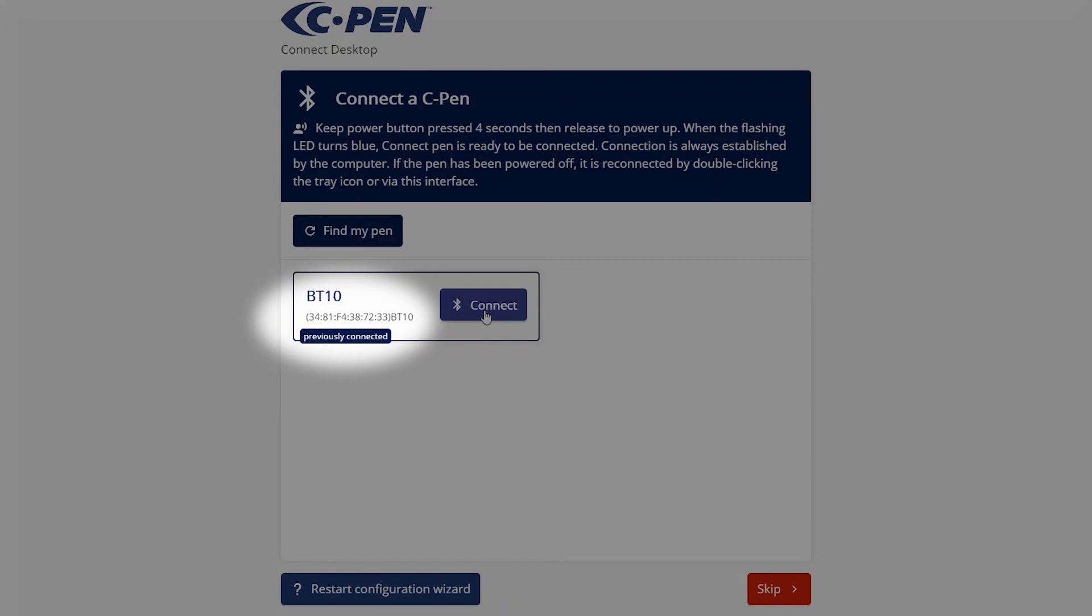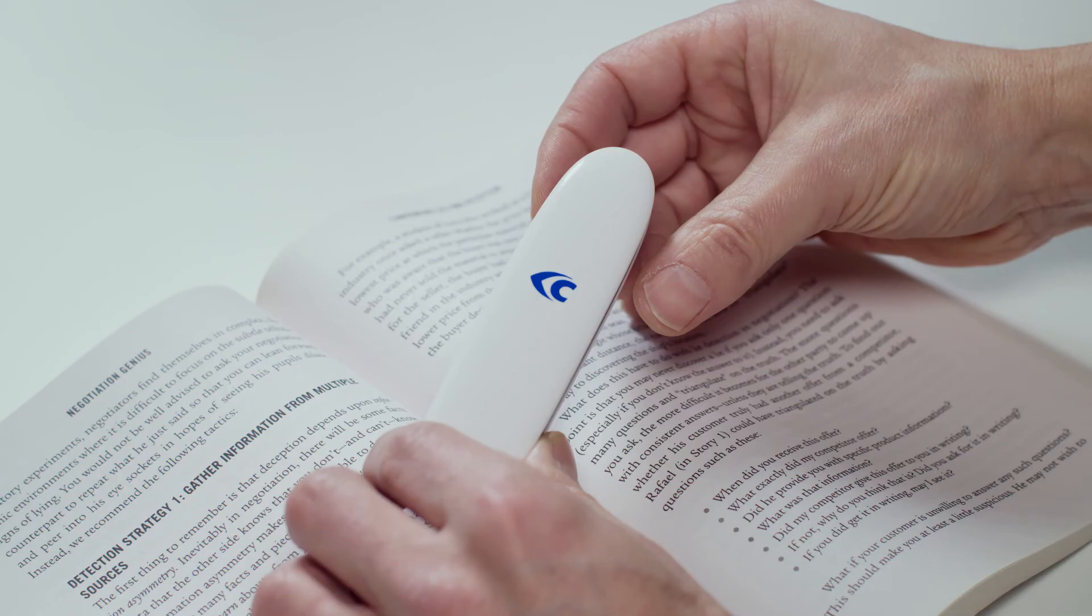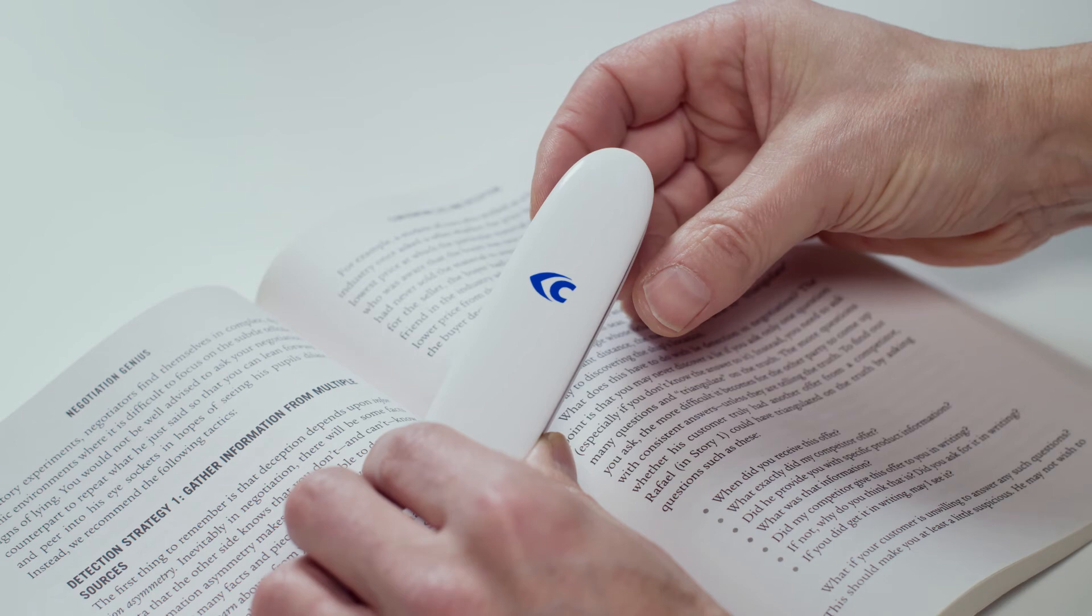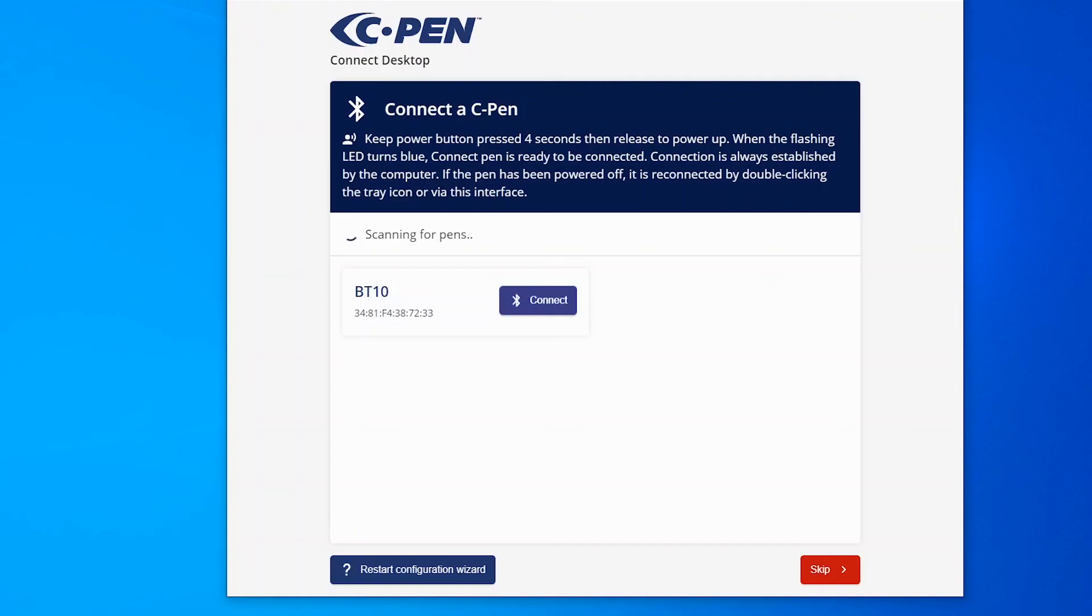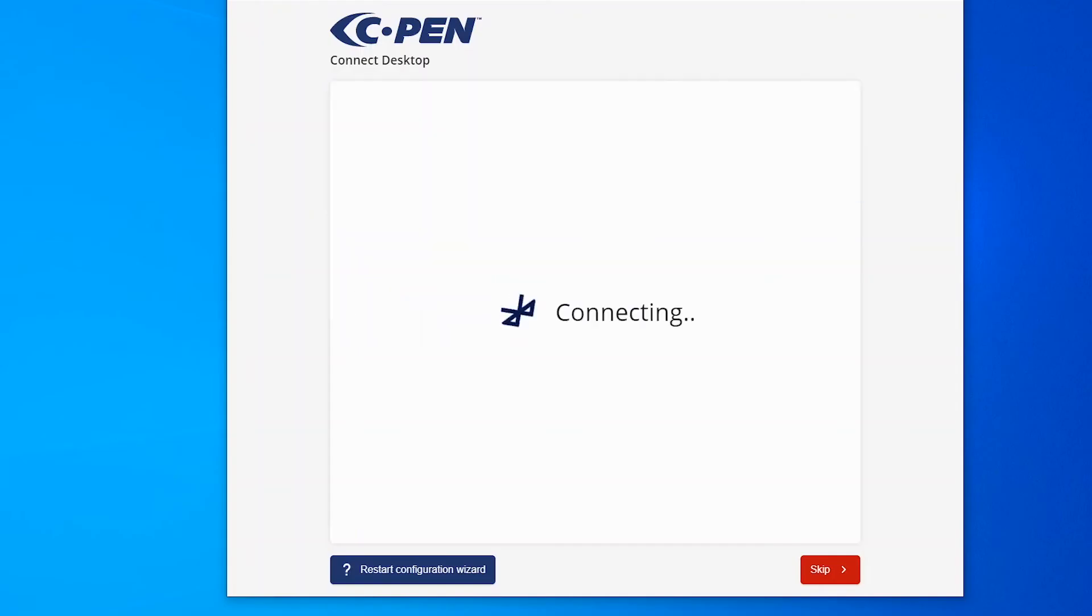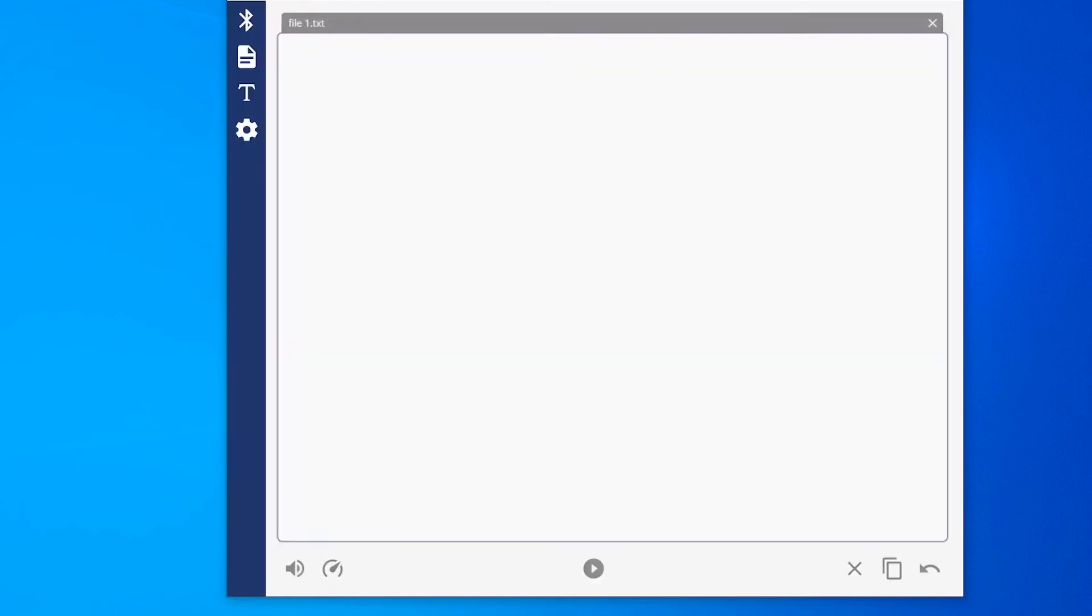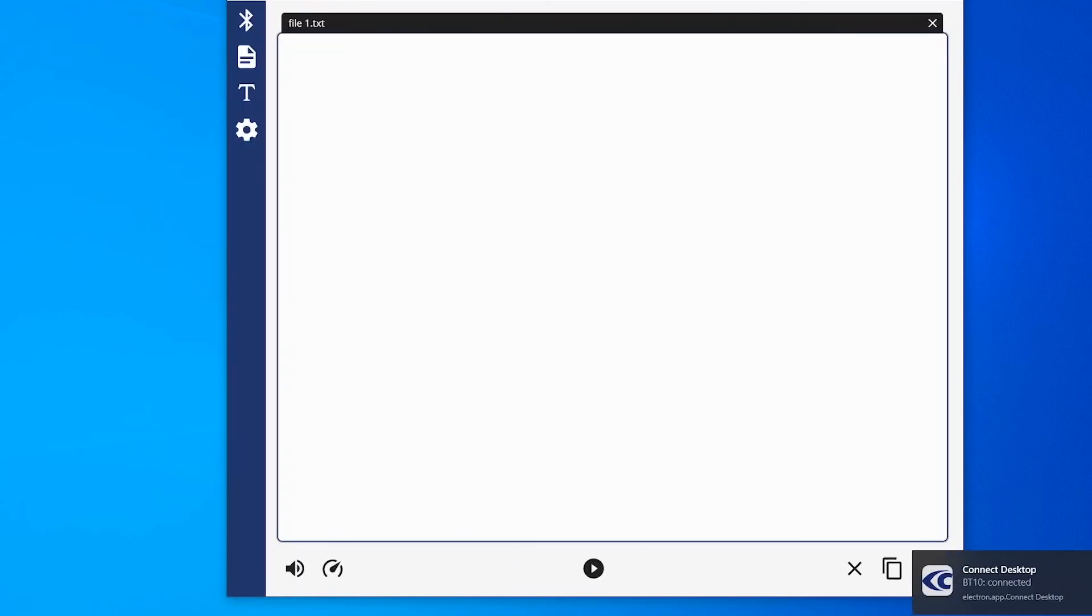Note that it is always the computer that connects to the pen. If the pen changes to standby mode, the link between the pen and the computer is automatically re-established when the pen re-enters normal mode. If the pen has been powered off, connection needs to be activated from the computer when the pen is turned on again.